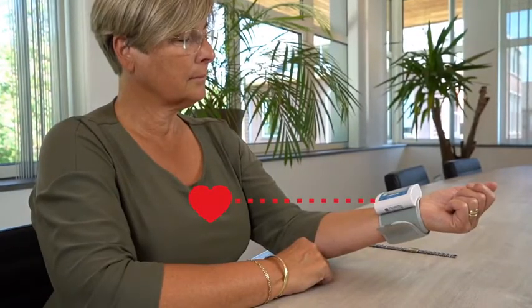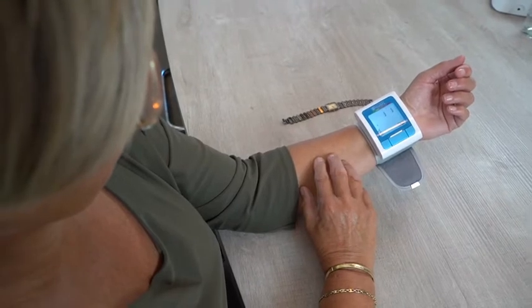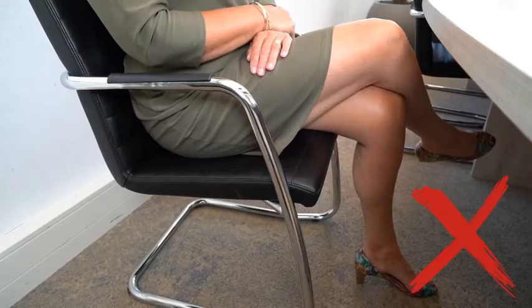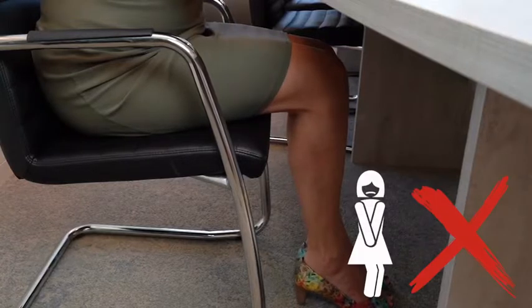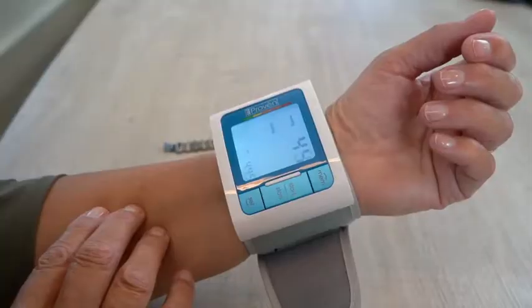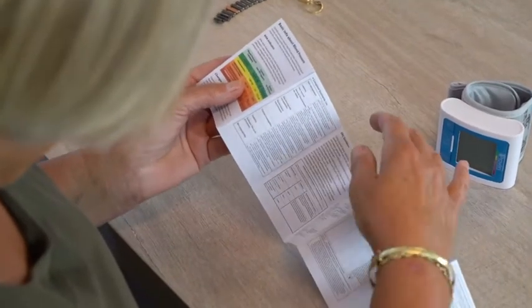When you actually start measuring, your readings can be influenced by small details. This is how you really measure like a pro. Do not cross your legs while taking a measurement. Do not talk while measuring. Do not take a measurement when you need to go to the bathroom. Sit comfortably with your wrist at heart level. Sit as still as possible. Follow the instructions to ensure accurate measurements.